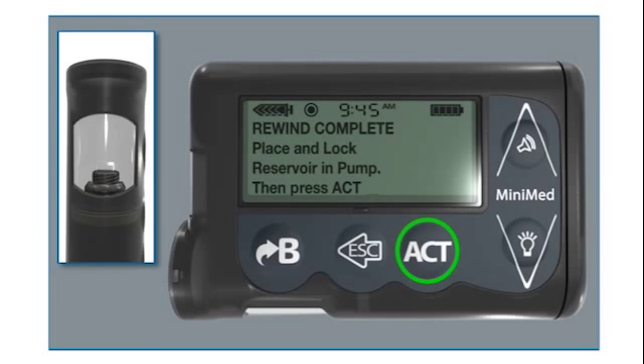You can now set the pump down and prepare to fill the reservoir.